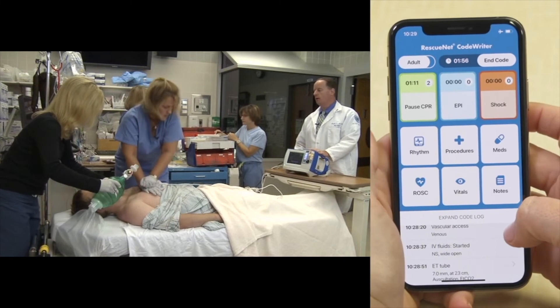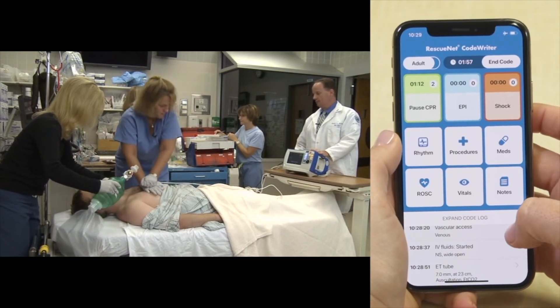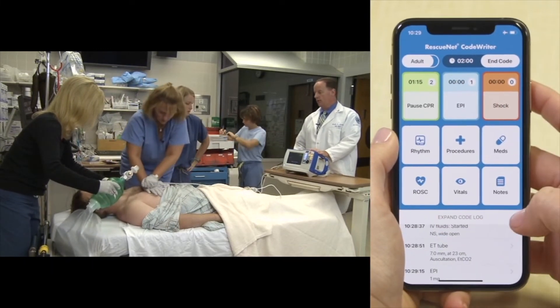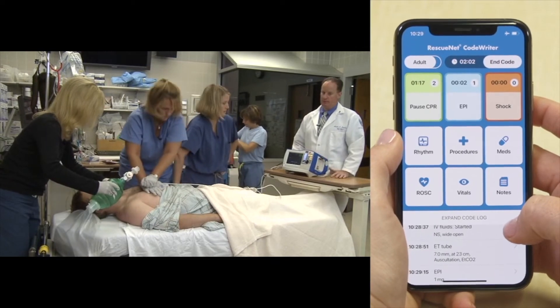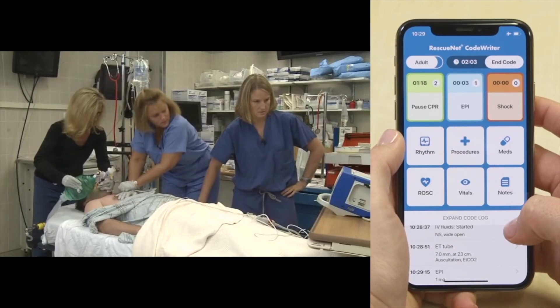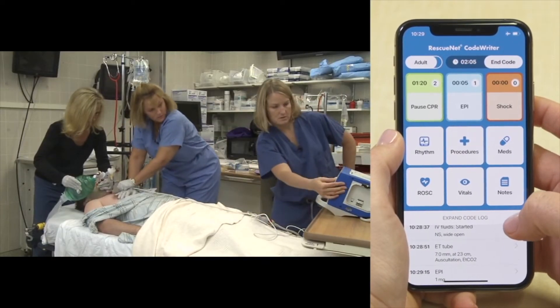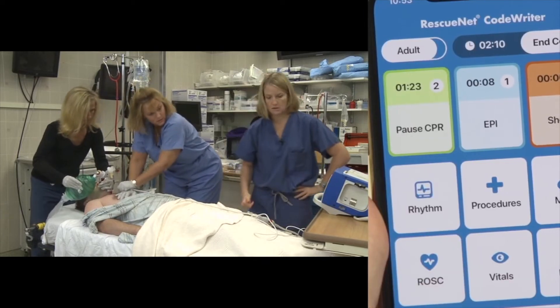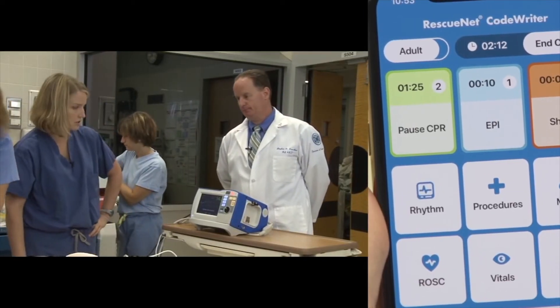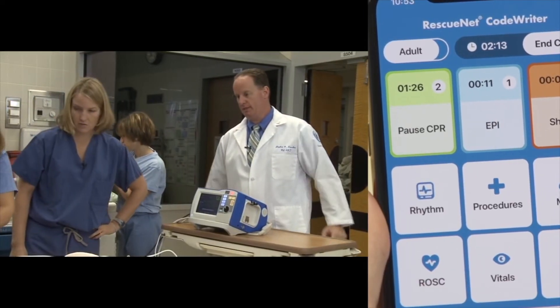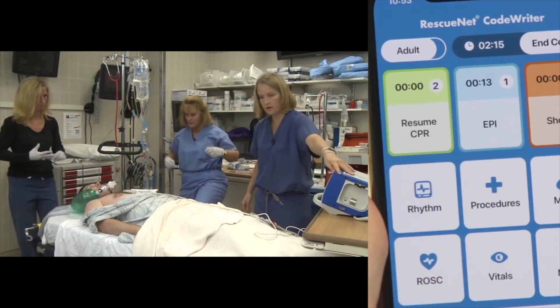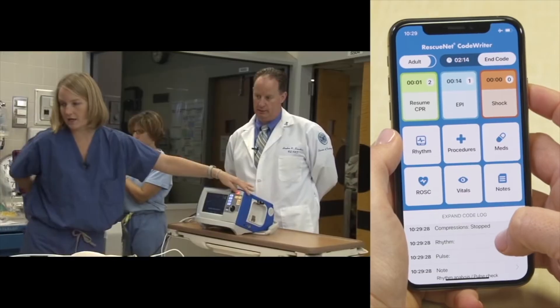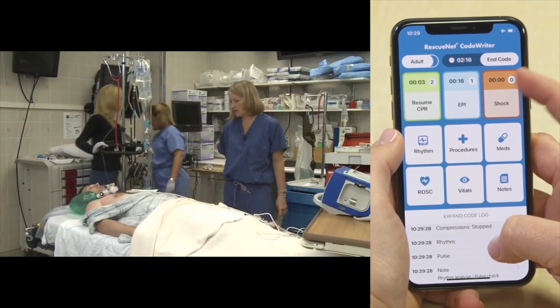At the two-minute mark, the team gets ready to defibrillate. Defibrillation is performed at 120 joules. Everyone stands clear and the shock is delivered. CPR is immediately resumed following the shock, with a switch of the compressor. The rhythm is still V-fib after the first shock.